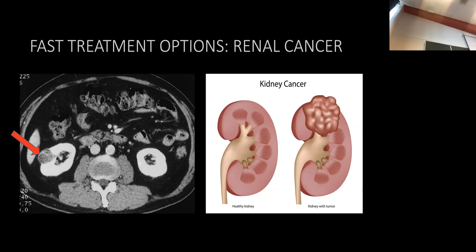But you can also see within the kidneys, there's this growth, which is abnormal. And well, this can give the urologist reason to perform a biopsy, because basically two things can happen. It's either a benign growth or a malignant growth, and the latter really needs to be addressed, of course.